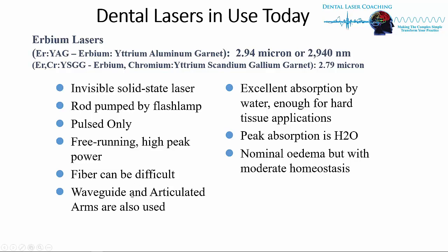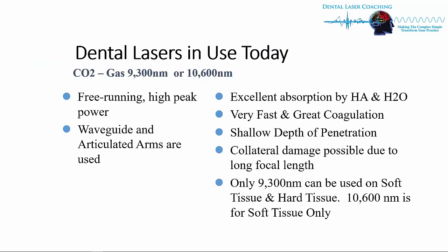It's much easier to do through a waveguide or articulated arm, and I'm going to go over the pros and cons of those later. But again, excellent absorption by water. We can work on hard tissues, be it tooth structure or bone, and its peak absorption is H2O. Very, very little trauma or edema, but very minimal to moderate hemostasis.